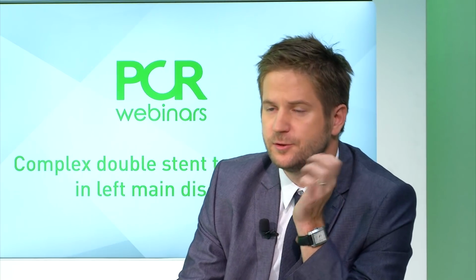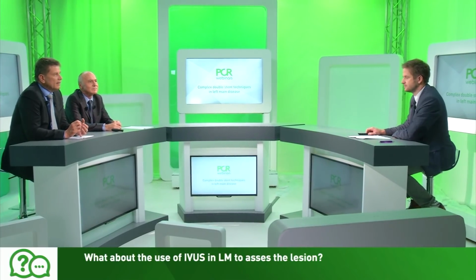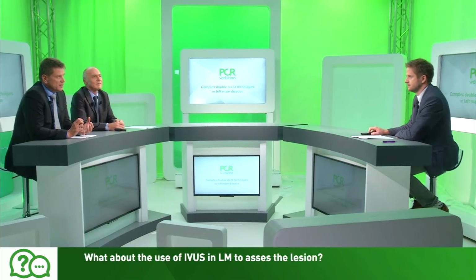What do you think about using IVUS prior to deployment of stents? Is it necessary, useful, mandatory? Well, it depends on the case. I know that there's a strong movement to use intracoronary imaging and strong recommendations also to use imaging in left main. My first point would be to ask, what is the question that I have? Do I have doubts about the sizing? Do I have doubts about calcification? Do I have a difficult anatomy where I need to understand something? What is my precise question? This would then answer the question of whether I would like to use additional imaging.